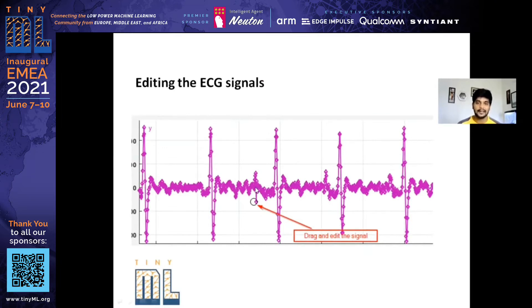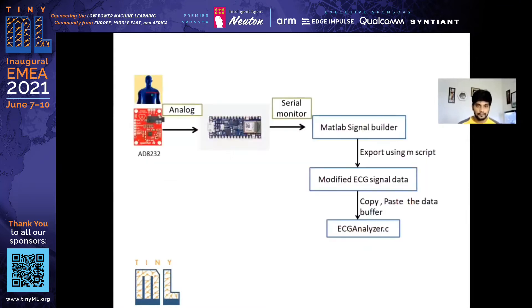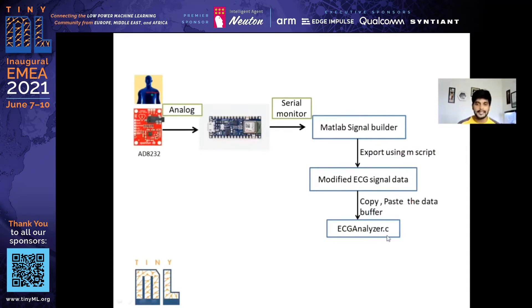I edited my normal ECG data to look like atrial fibrillation cases and also first degree heart block, which is the AV block one case — I could drag and modify the waveform to resemble the other two cases. Once that modification was done, I exported the data into a data buffer so I could use it in my code, storing it in an ECG analyzer .C file I created for the project.